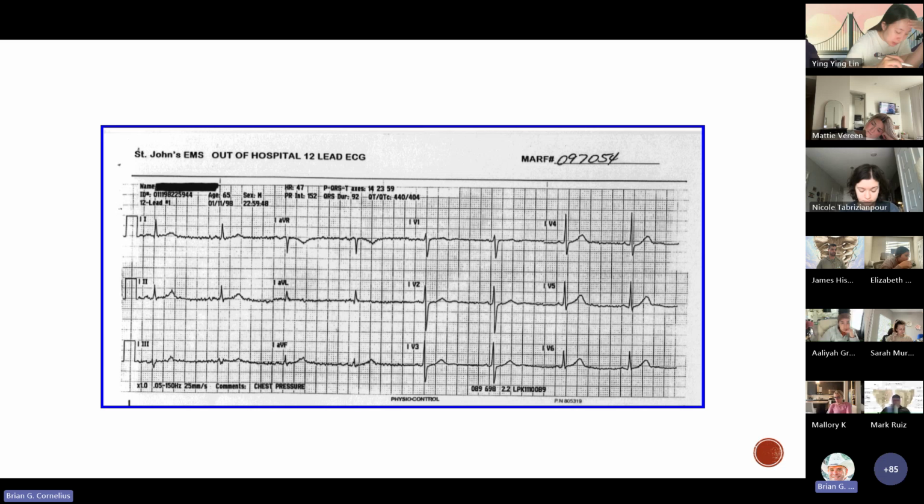So if you skip through the age of the patient, it may miss out on some of the interpretation data. It may also give you vague statements like correlate with age, correlate with clinical condition, because it may not have all the information it needs for that interpretation. So make sure you put in the age, sex. A lot of times that's also how it gets reported to the patient's EMR or billing.